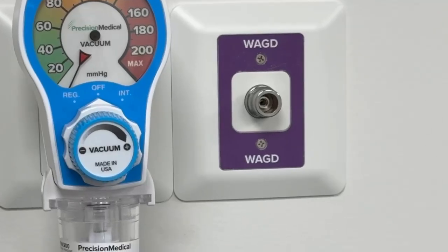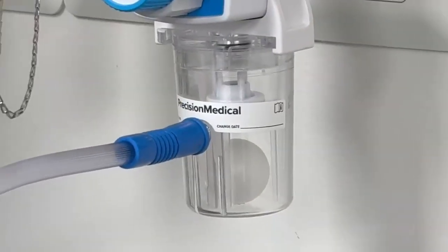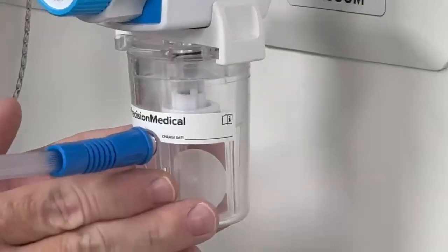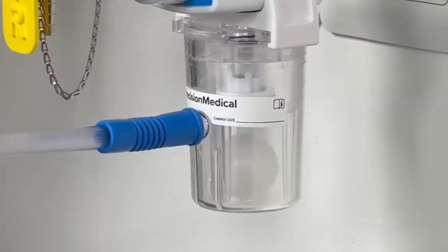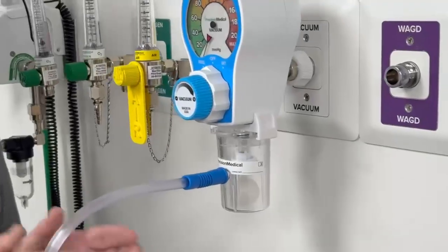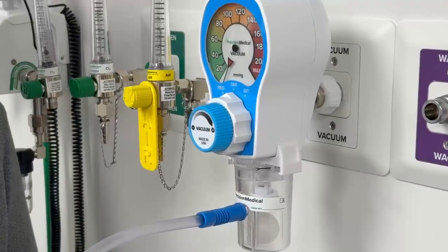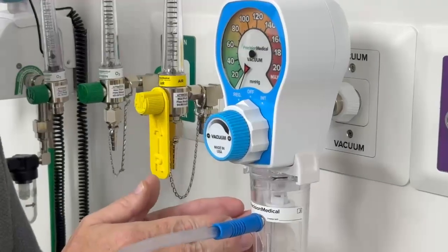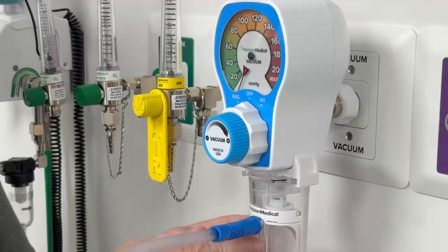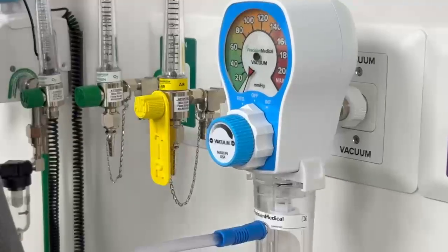The PMX 900 trap has a lot of features to it. The ping pong ball style ball at the bottom is where the vacuum trap works as a traditional vacuum trap, trapping any debris or fluids that may get past the canister, or if hooked up incorrectly where fluid is directly sucked into the vacuum trap — it will stop any fluid from progressing through the system.